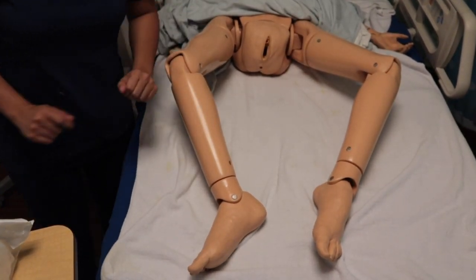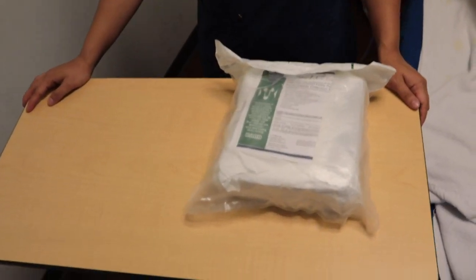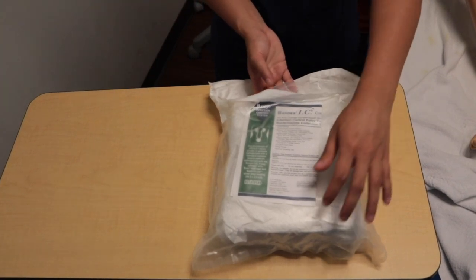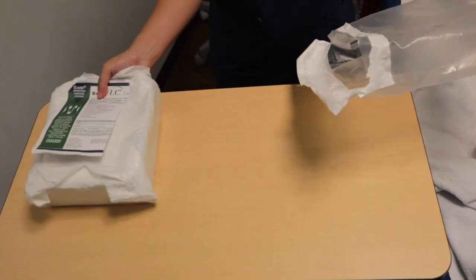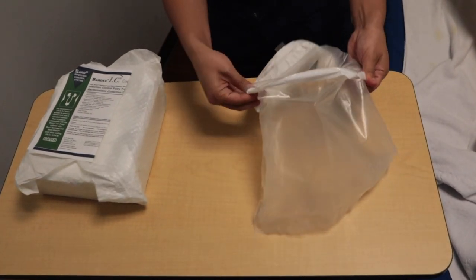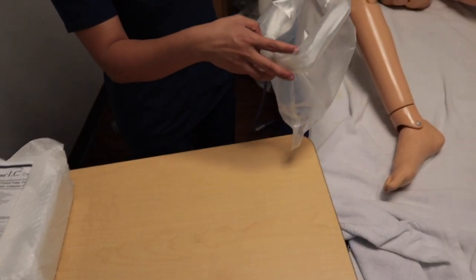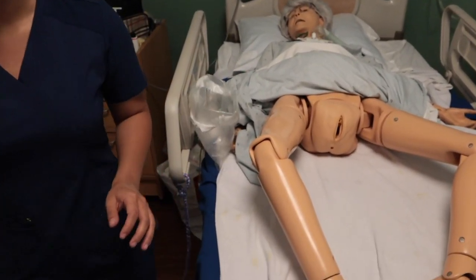That is important because you don't want the patient moving around and run the risk of breaking your sterile field when everything is set up. I will now remove the inner kit out of its plastic packaging. Set the kit aside. Roll the plastic packaging into a mini little trash can, and put it on the side by the patient. This will be handy later when I am disposing my trash.